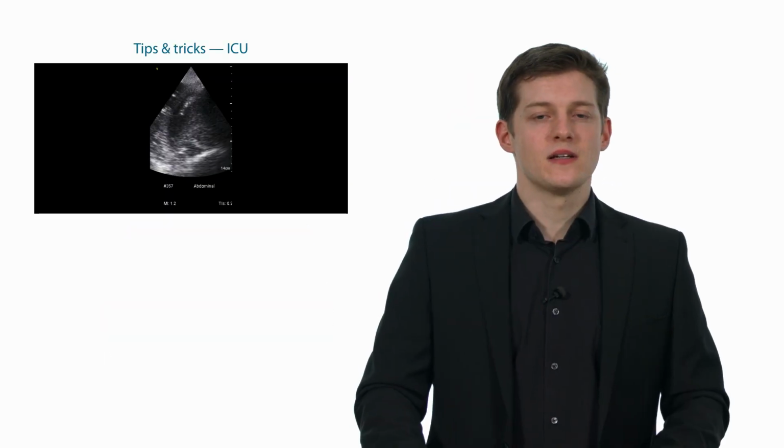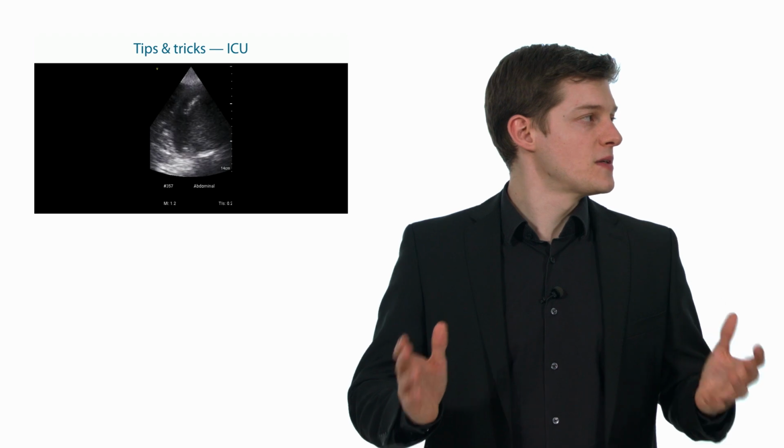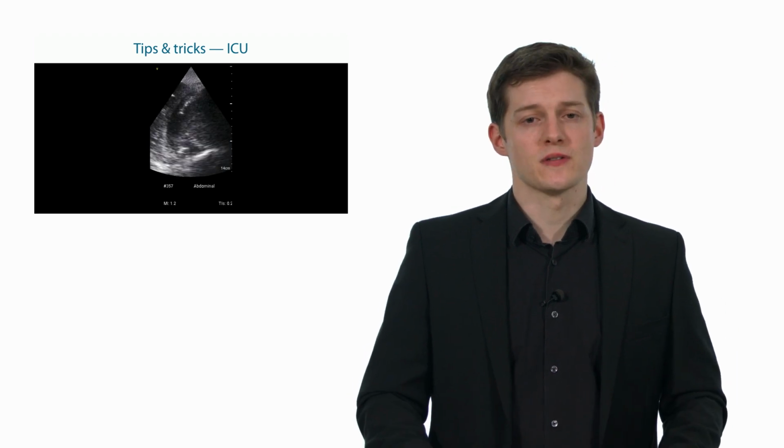Now, in reality, we see many of our patients with pneumonias on intensive care units, and there it's sometimes very difficult to perform a thorough exam. They might even have chest bandages and all sorts of difficulties that make it difficult to image the lung. What are some of your tips and tricks? Basically, there are some really easy tips and tricks to scan those patients.